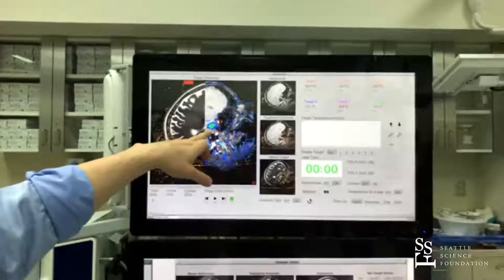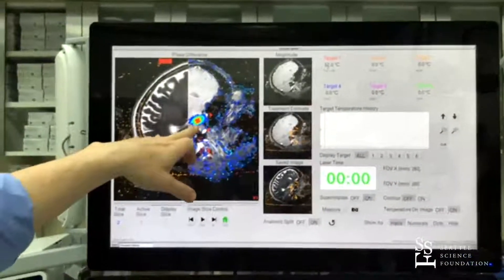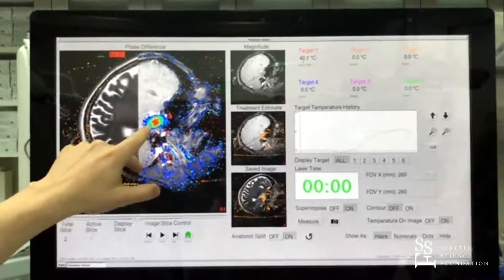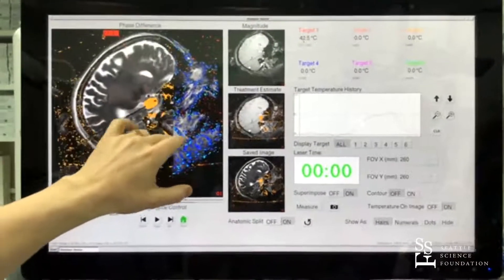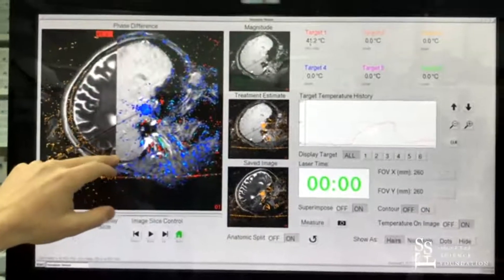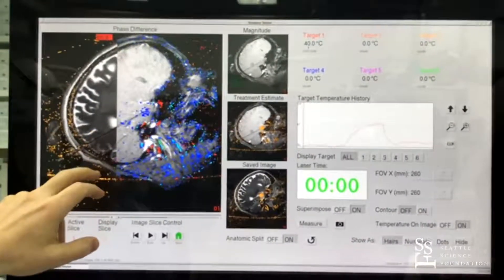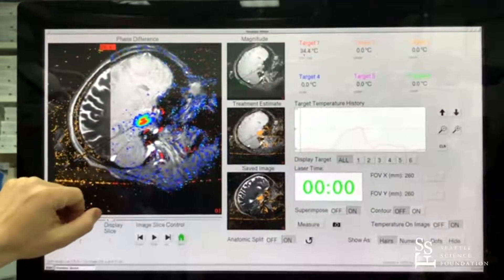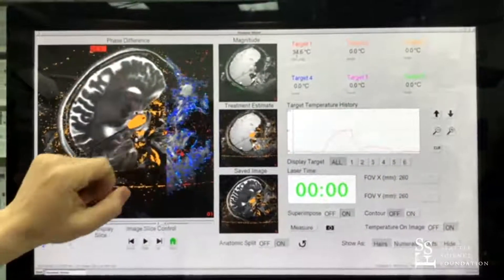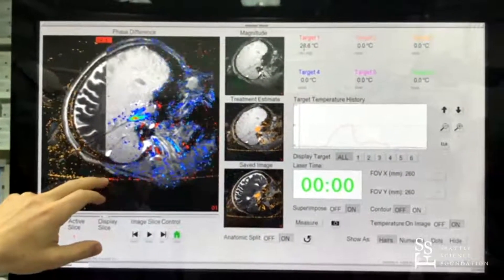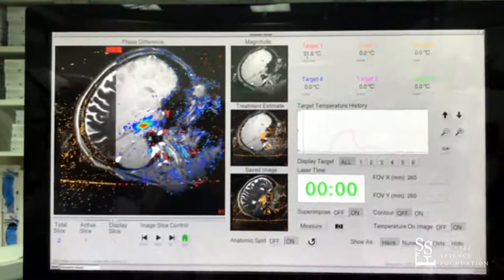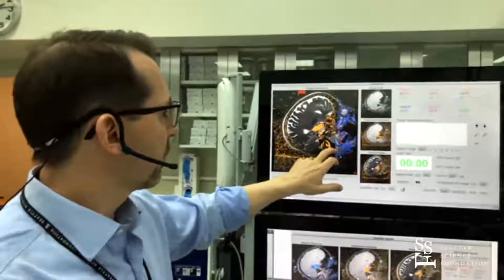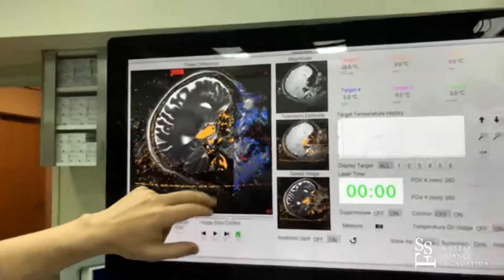What we're seeing here is a live — or mock live — image. You can see the thermal change, there's a heat map, and here's a map of what's actually being lesioned versus the live temperature change. If we were to turn the laser off, the heat map would go away as the tissue cools down, but the map of what's been ablated would remain. Here it's cooling down because the laser has been turned off. Now we've pulled the fiber back and we're ablating about a centimeter behind the first ablation, with the historical map building of where we've ablated along this fiber.